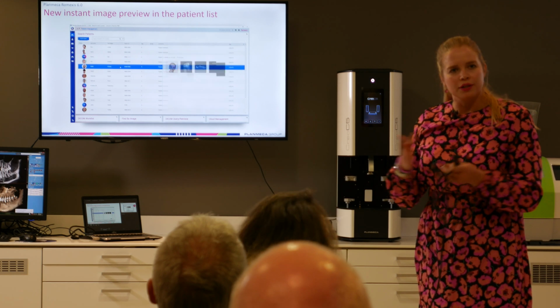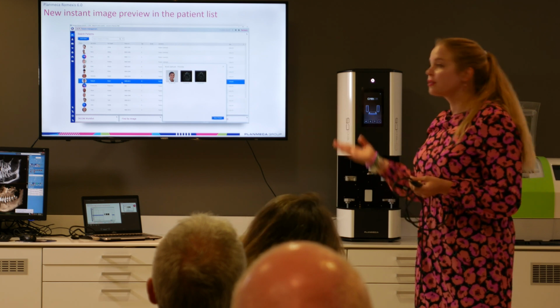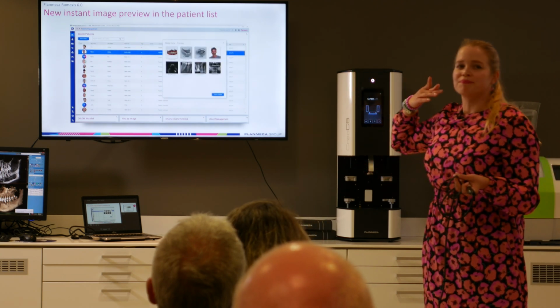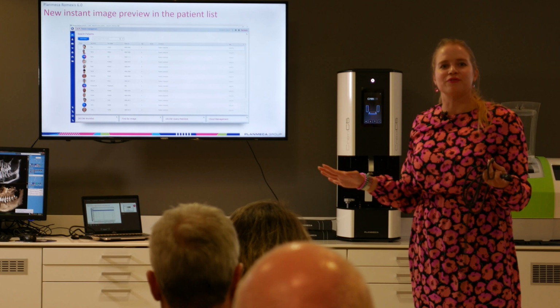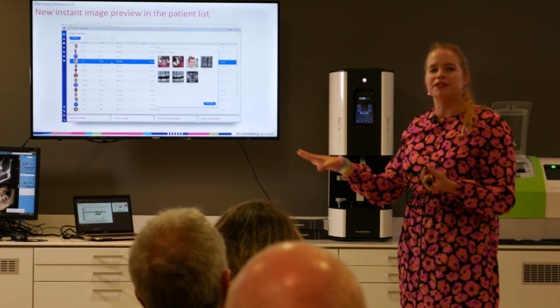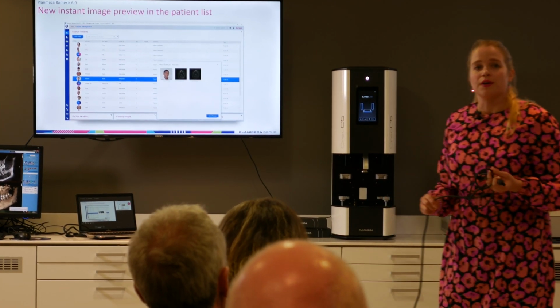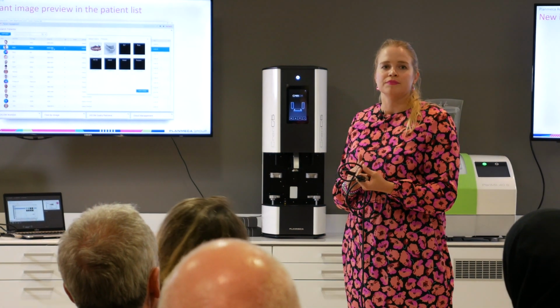Yeah, but you do have the integration of your Exact and Romexis, like you can search for patients, because Romexis doesn't have, and it's maybe unlikely that we will have at any point, practice management inside Romexis, because I think that there are so many different patient management software in the world because of all the localization, you know, like all the taxation, billing, everything is so different from one country to the other, and there are so many different software in the market. So I think our solution will be to integrate them with each other also. So we'll be still running two databases.